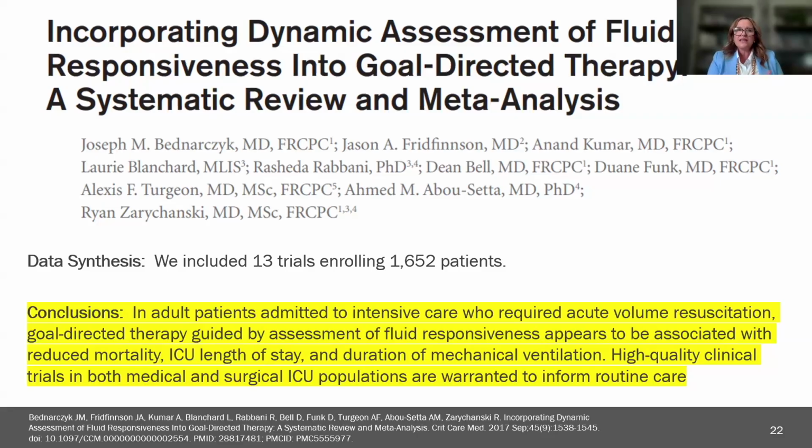So I just think many times we sometimes have non invasive hemodynamic monitors like in the closet, right? I say get them out and utilize them to help you determine if a patient and know if your patient can take and receive this volume to help perfusion. Next slide.